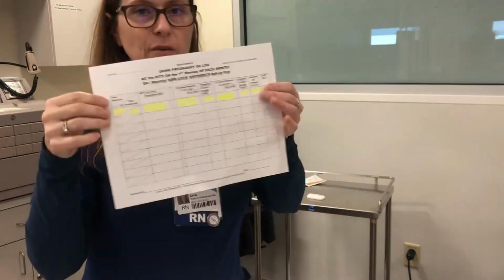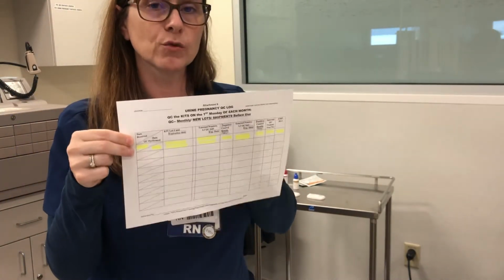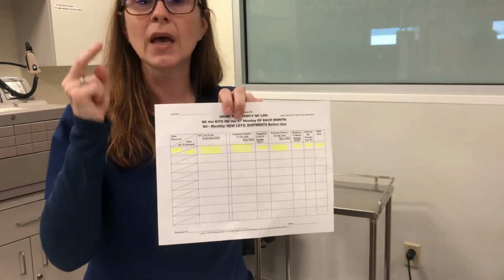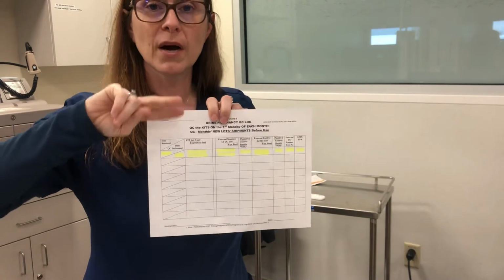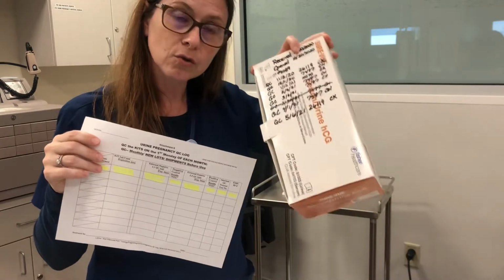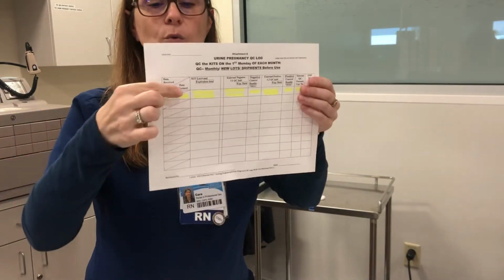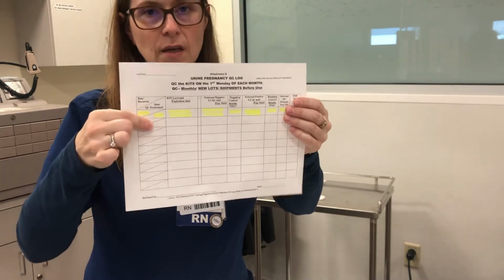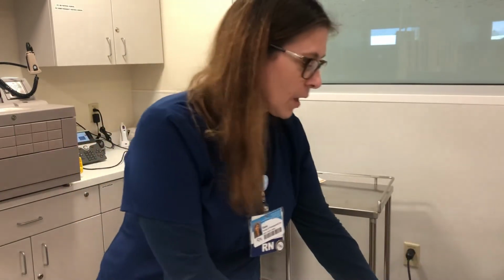So this form has to be filled out every single time you run QCs. So if it's a new shipment, if it's the first of the month, you're filling out this form. If you have 2 boxes, so say you have 3 cartridges left in one, and you have your new kit, you have to QC both boxes. So that would mean you would run 2 cartridges on this box, 2 cartridges on the new box, and you would do 2 separate lines. One line for the first box, the second line for the second box.